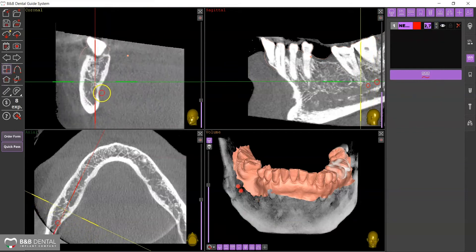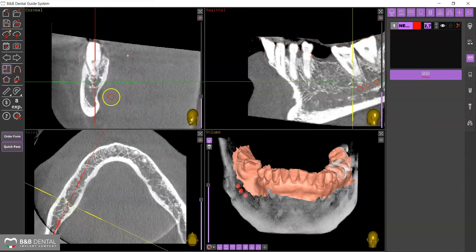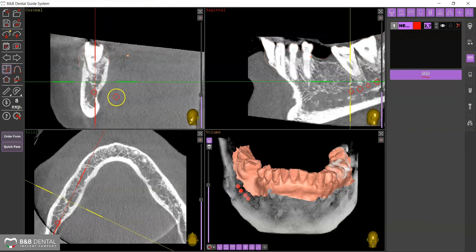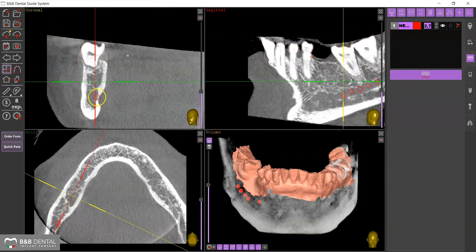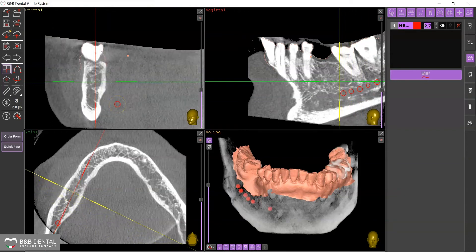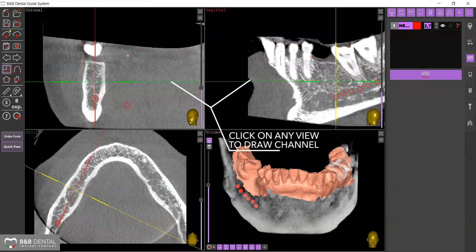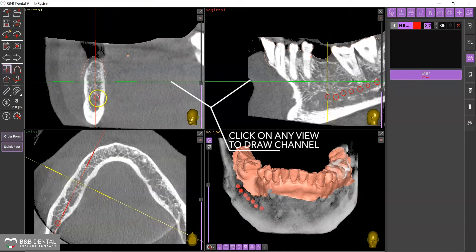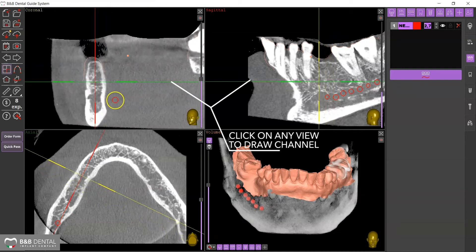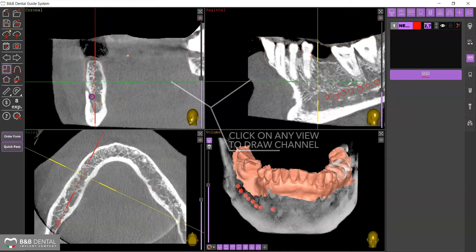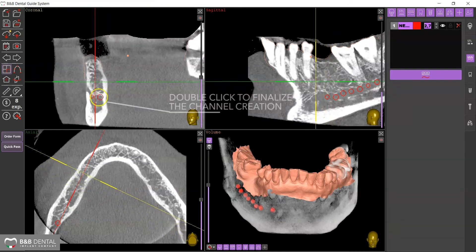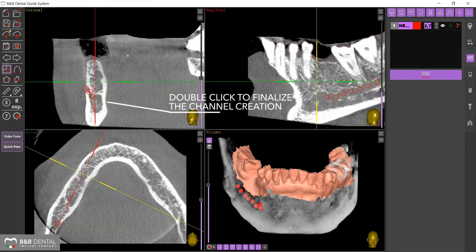With the help of the mouse wheel, move forwards and backwards along the axis and click to indicate the canal. Double-click to complete the action.